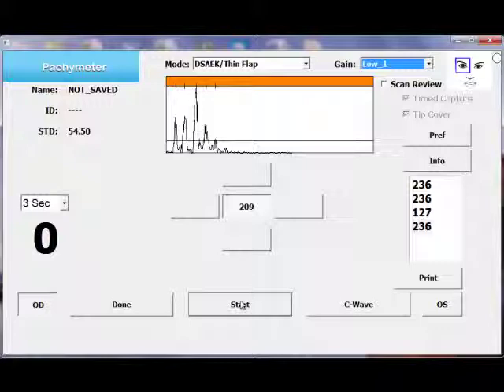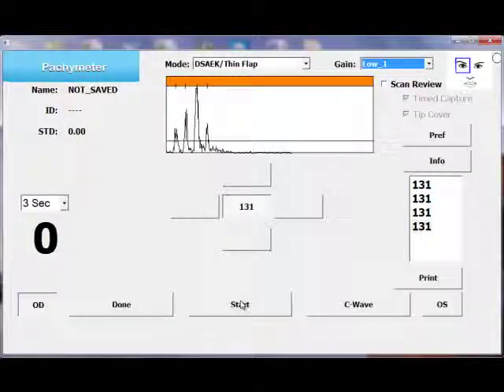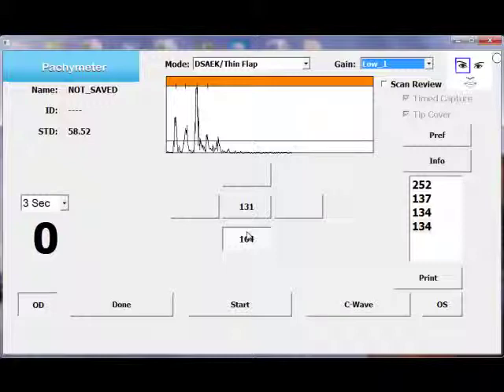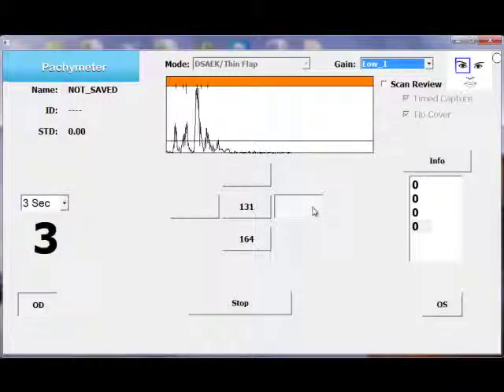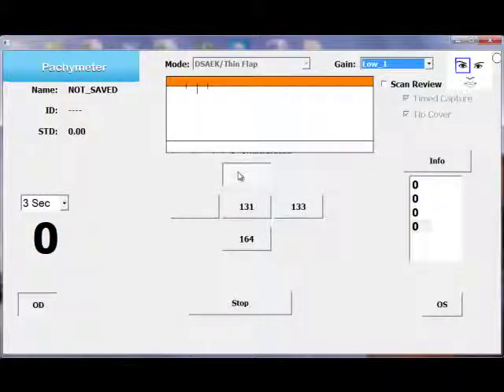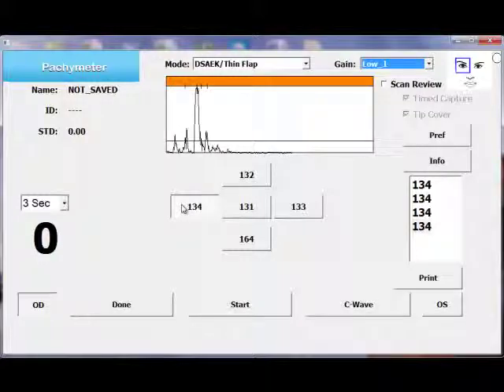Let me try again. 131 microns. Different location on the film — scanning. Different location on the cornea — scanning. You can see that the measurements are very reproducible throughout.